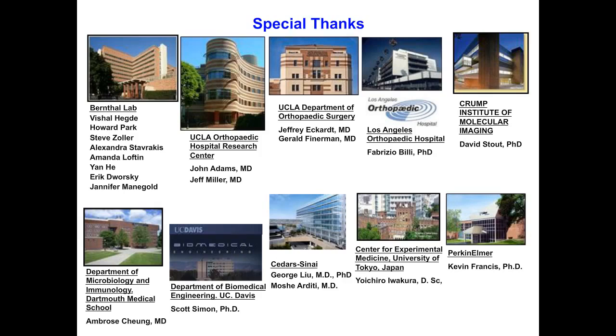Dr. Lee, what kind of contrast agents can you inject in high-resolution micro-CT? So in micro-CT there are many different types of chemical compounds that you can inject. Generally speaking, iodine-based contrast and gold nanoparticles are some of the main ones that are being sold commercially. Relatively inexpensive. Iodine seems to work really well.